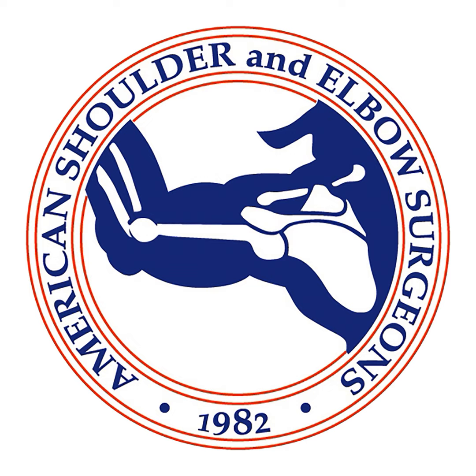Now you say tendinopath. Is that like you're looking at the pre-op MRI and deciding that, or is that something where you're in the operating room, you're placing your stitches, you're realizing they're pulling out, and you're thinking we need the patch now? Yeah, it's looking at the tendon directly and looking at the quality and making a subjective assessment of it. The tendon frequently has a lot of fibrillation. There's a lot of fenestrations in it. It's just a really poor quality collagen. In those cases, I think adding in a patch may be a benefit.